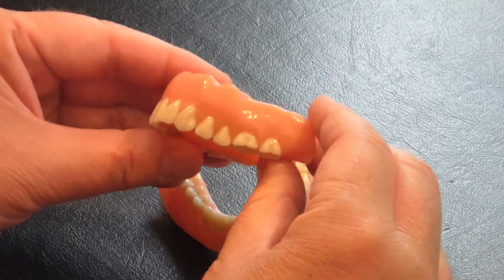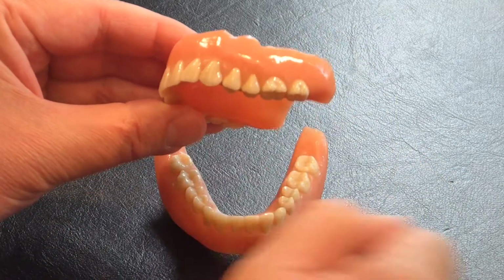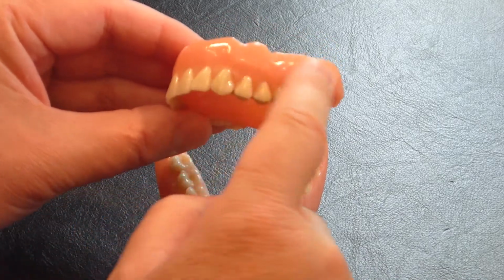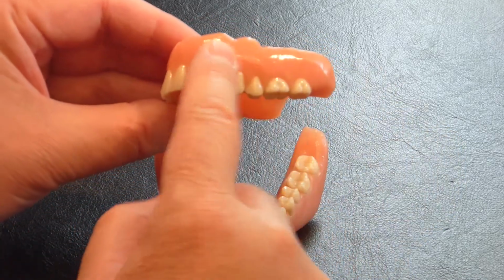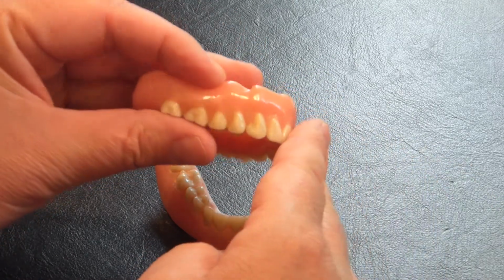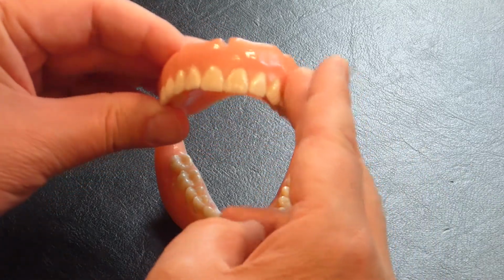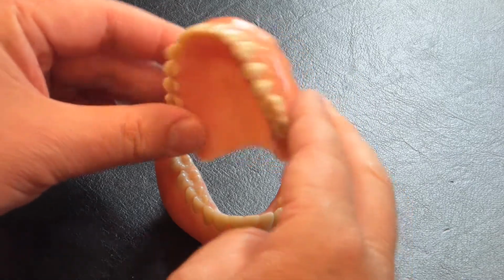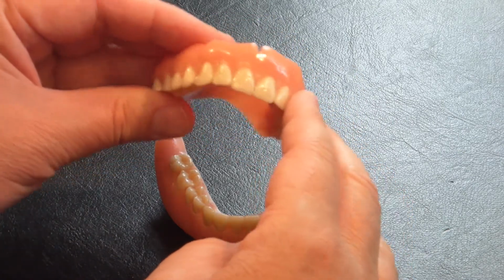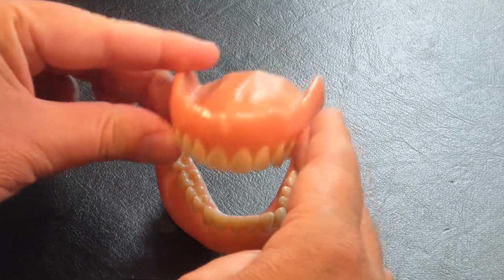Don't use toothpaste when you brush them. The toothpaste is actually abrasive enough, you can scratch up the plastic, and once the plastic gets scratched, plaque and tartar will stick to it, stains will get into all those little scratches. The denture just won't look as nice. A lot of times that can be corrected though at the dentist's office.